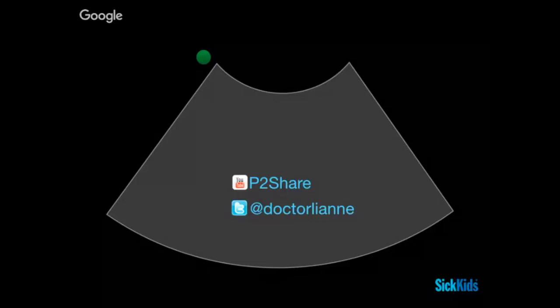One of the things I would say about peritonsillar abscess is when I started working at this institution, and Mark showed me this scan, we did it in a patient, and got quite a lot of surprise from different subspecialists. So the radiology department was quite surprised that we were doing this. ENT was quite surprised that we were doing this. And now, after a few years, you're starting to see this body of literature being built up in radiology and in otolaryngology that supports and advocates for more ultrasounding in some patients where the risk of CT may be a bit higher.